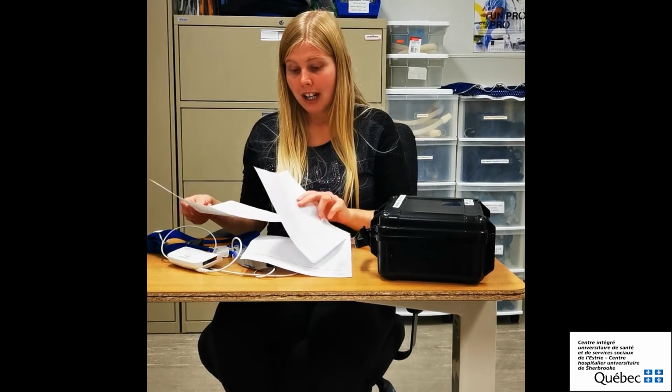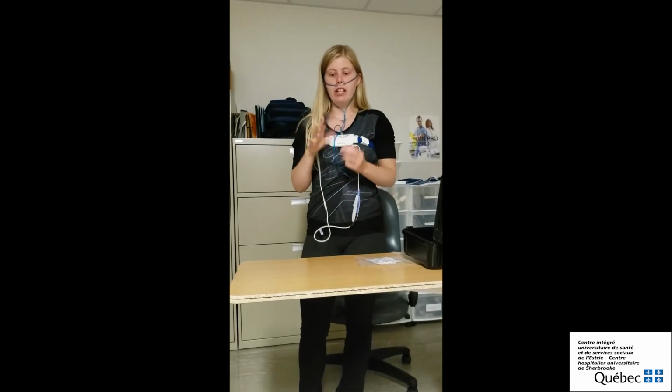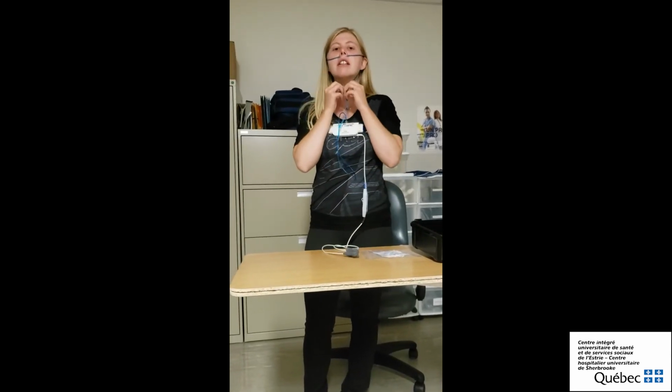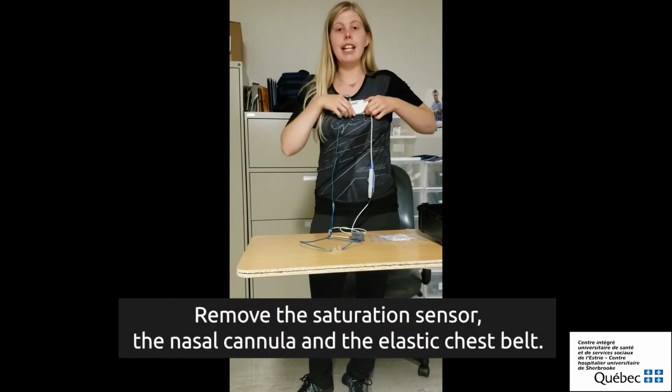The next morning, fill out the sleep journal paper to let us know how your night went. With all this information, we will be able to analyze all the data better and determine if you suffer from sleep apnea or not. In the morning, remove everything and the machine will close itself after a few minutes. Just put everything back in the box and bring it back to the hospital.